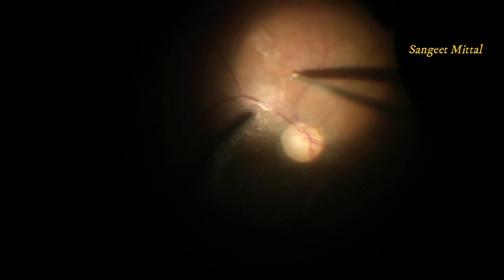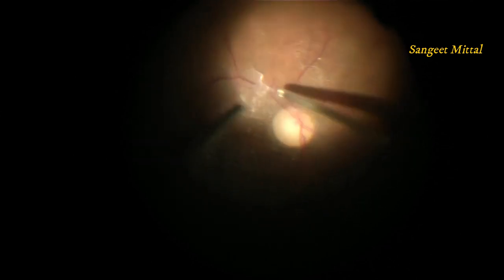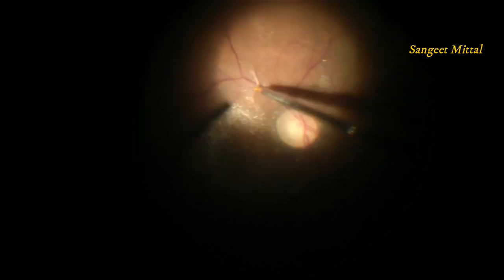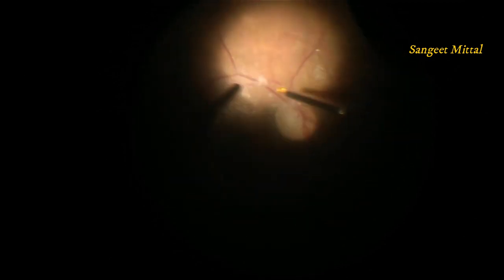In the last, just to show how tough it is to remove this layer of vitreous, vitrectomy was completed, and a layer of organized vitreous hemorrhage is seen in the periphery. This hemorrhage alerted us to the presence of vitreoschisis. Active suction was applied in the periphery, but this layer could not be separated despite much effort. Triamcinolone was injected. Triamcinolone was able to stain the vitreous at the disc, but the PVD could not be induced either with the vitrectomy cutter or soft tip cannula or even with forceps.